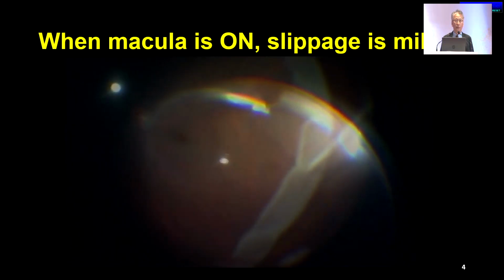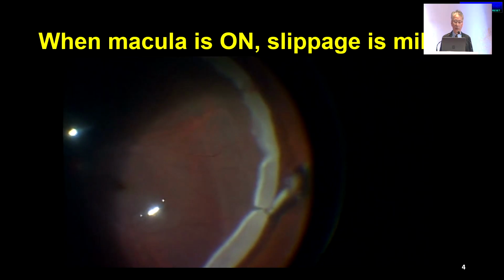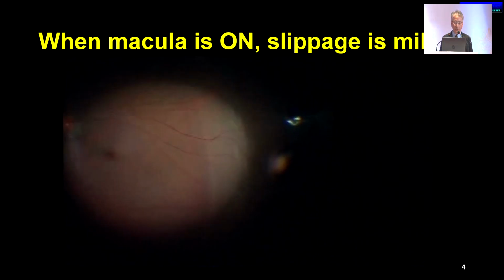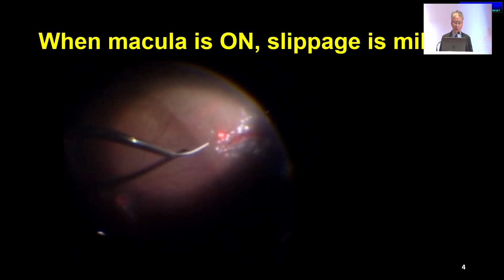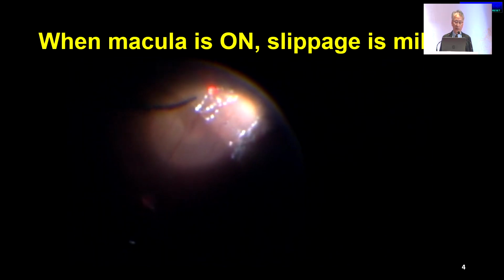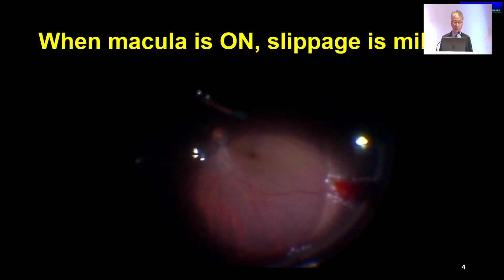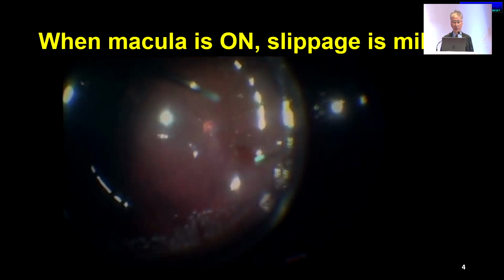I tried to conform the shape of this detached area to the choroid. And when I saw this picture, you see that actually the radial cut is not deep enough, so I should extend it until the edge of this detached PVR area. So you can see that you can better conform this retina.